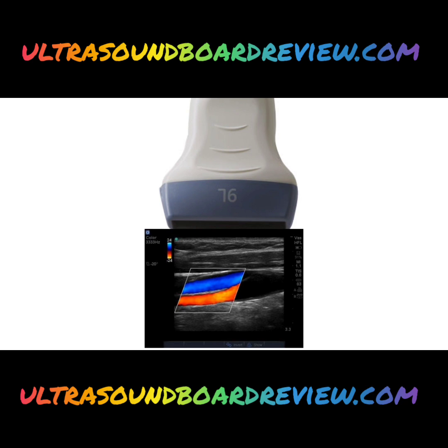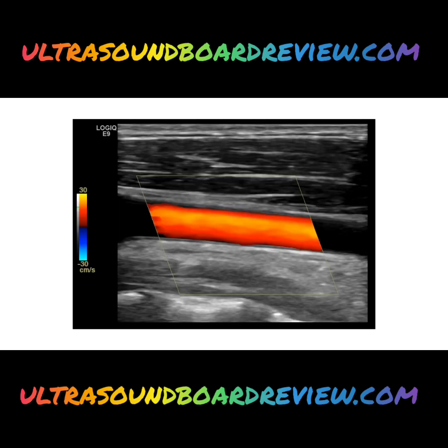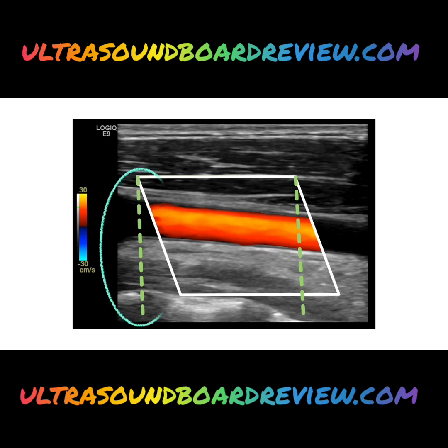So as you can see, this can be a little tricky to picture, especially if vessel angles are a little ambiguous. So we like to draw in a theoretical probe, and the following trick will tell you where to put it. This is what we're going to do. Here's our color box, right? We're going to locate the two top corners of our color box. Now from those two corners, you're going to draw two straight lines straight down from the corners. And then what you're going to do is locate which line that you just drew is falling outside of the color box, because that's the side where your probe is.